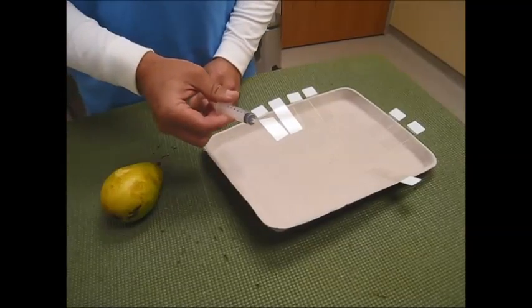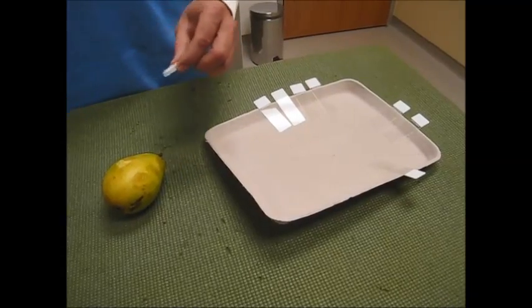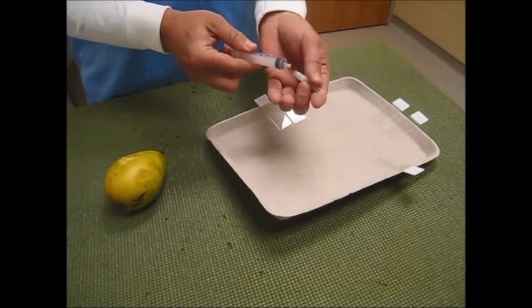First thing I usually do is I break the seal on the plunger for the syringe so that I can aspirate easily. Then you attach your 22 gauge needle.